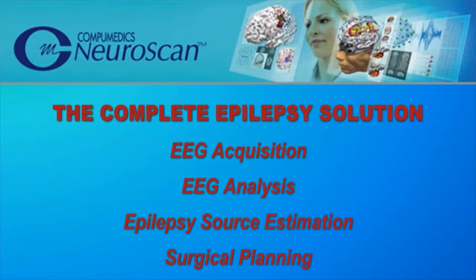At Compumedics NeuroScan, we provide the most complete solution for your epilepsy needs, from EEG acquisition to data analysis, through epilepsy source estimation to surgical planning.